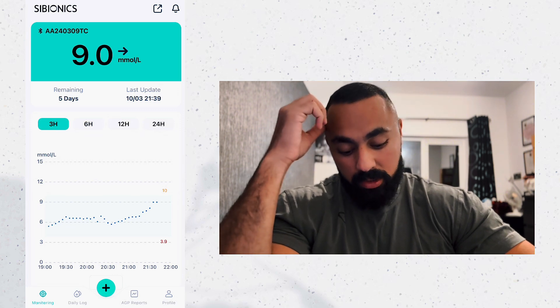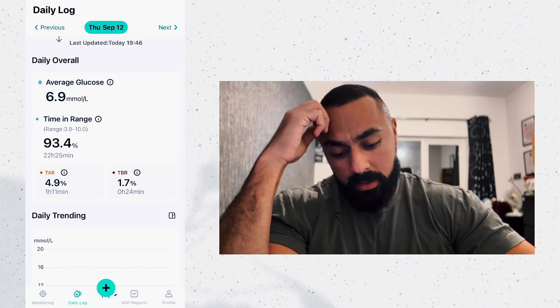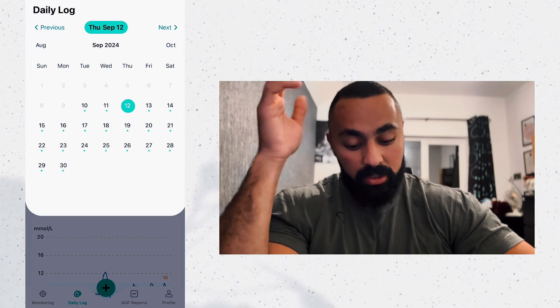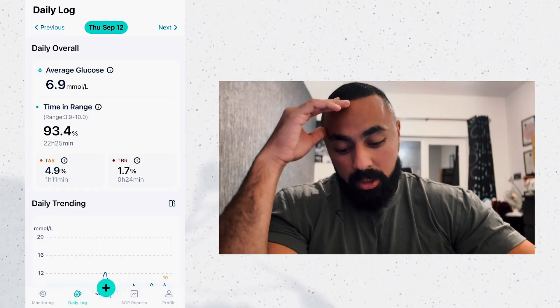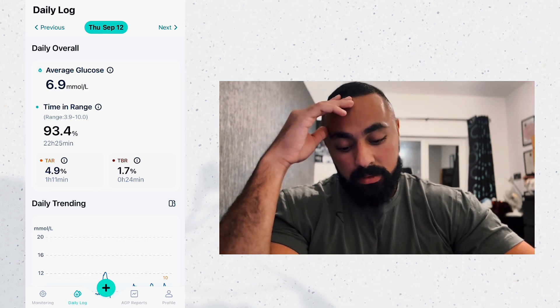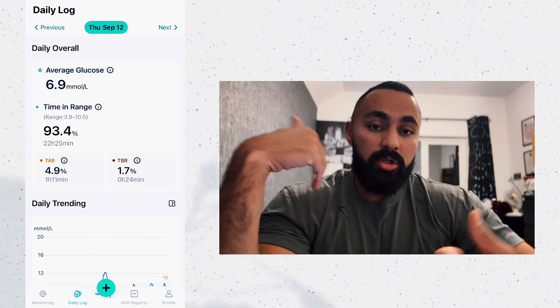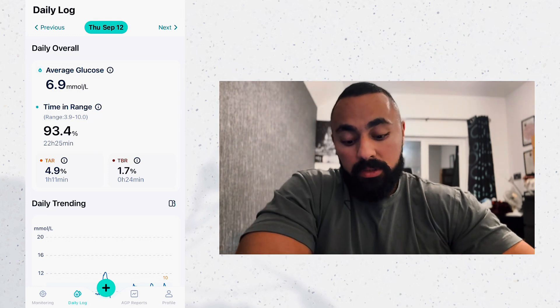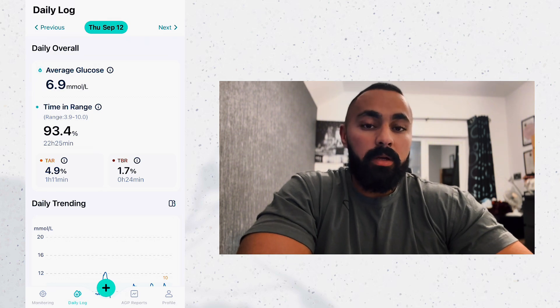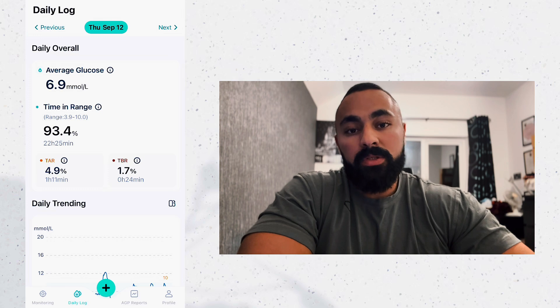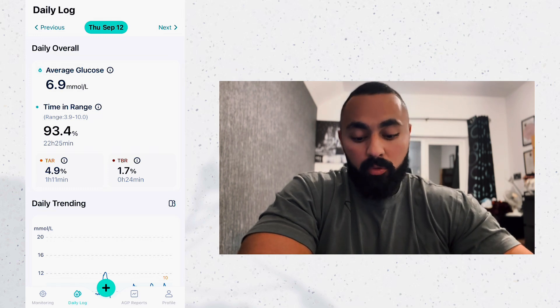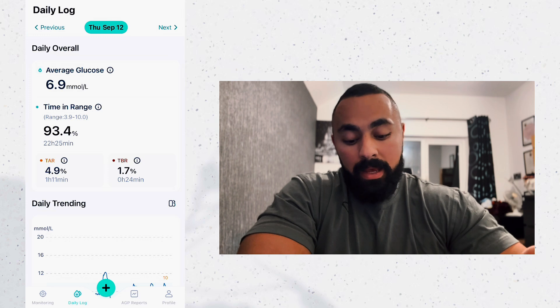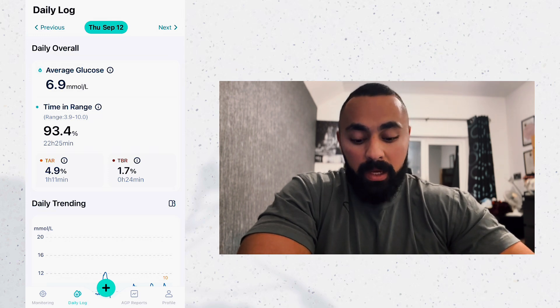Now let's go to the daily log. This is one of my days — the 12th of September. At the top you can change the days to whatever you want to check. It shows you first your average glucose, which is important — it's the range of your blood sugar throughout 24 hours. Then it shows you time in range, which is the TIR. This is very important — if you ever see a physician, coach, or diabetes manager, they'll want to improve this. That day I had 93.4%, which is great. I always try to target over 90%.